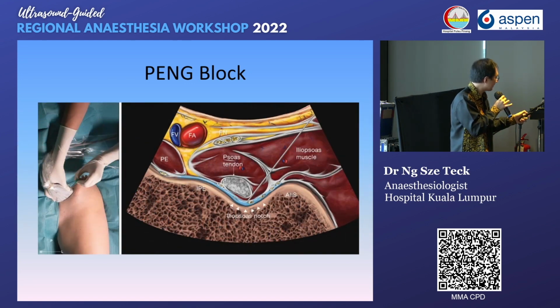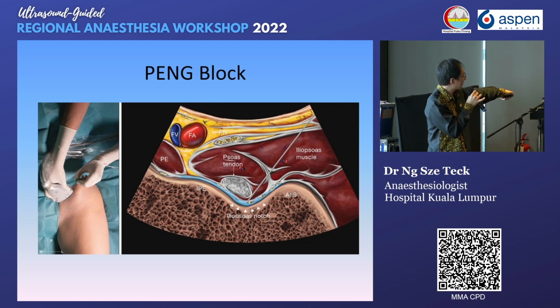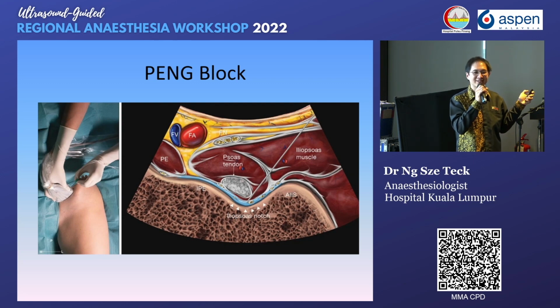Then you just place a needle. Of course, you need to place the needle in the musculofascial plane below the tendon. So far so good.